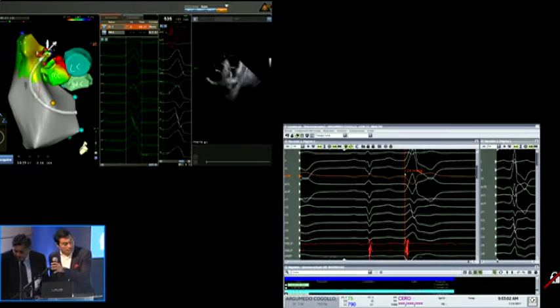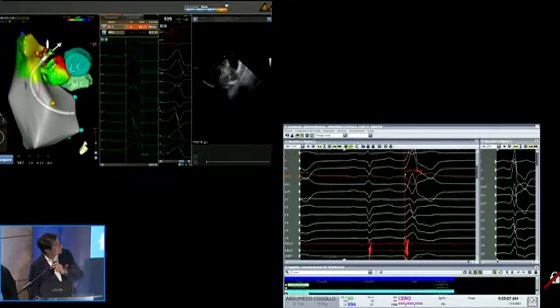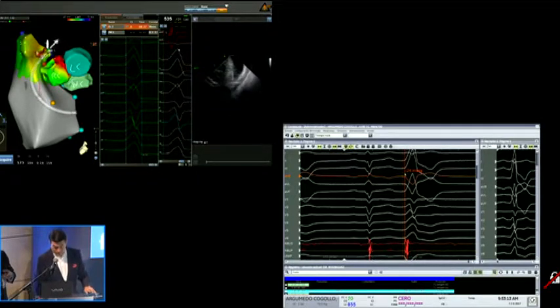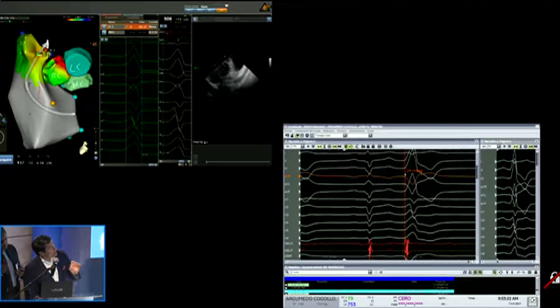When we come back to the laboratory, we're going to have that comparison. I feel that probably from the left side, I think that there is a good unipolar there that is starting in consistency with the other one. Well, we need to close with you.